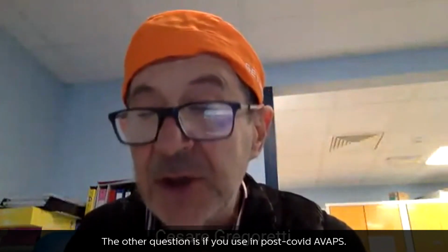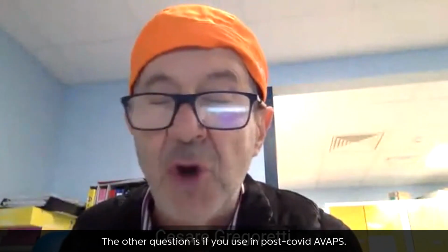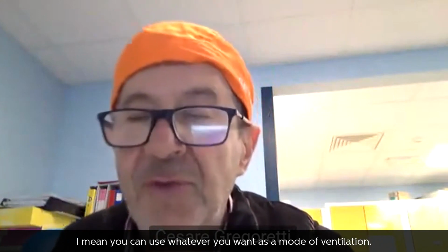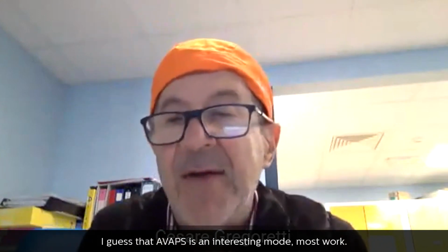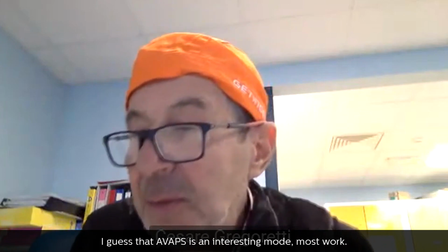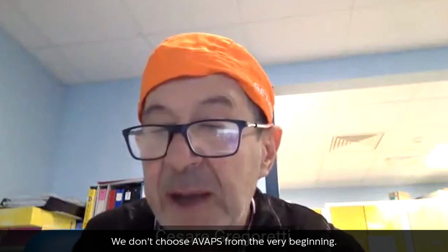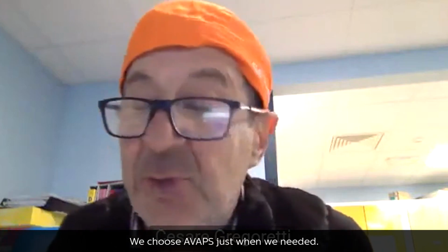The other question is if you use AVAPS in post-COVID. I mean, you can use whatever you want as a mode of ventilation. I guess that AVAPS is an interesting mode to work with. We don't choose AVAPS from the very beginning. We choose AVAPS just when we need it.